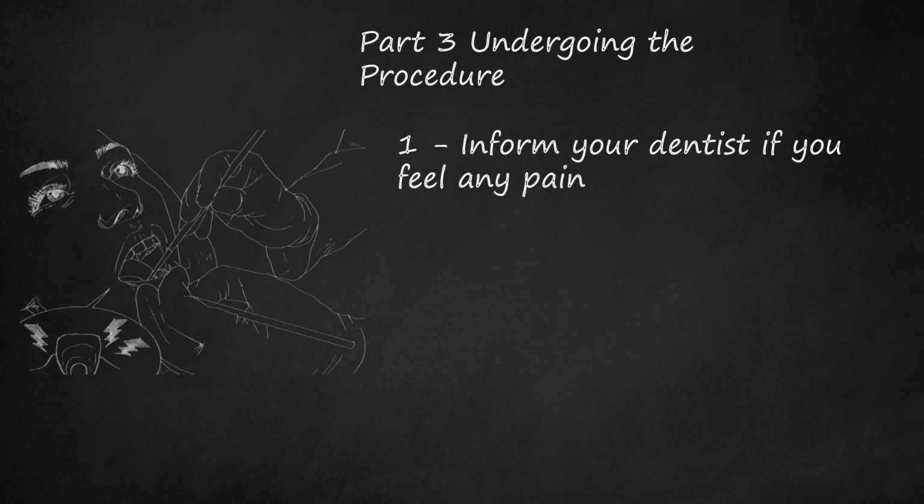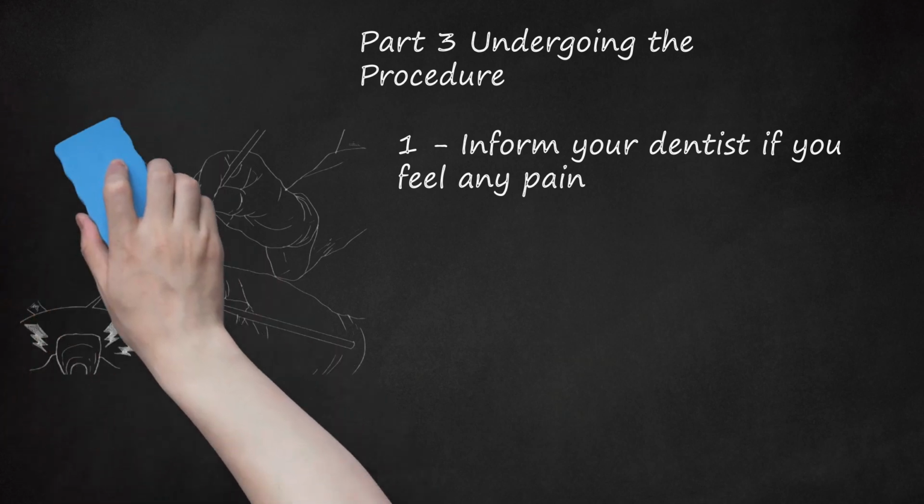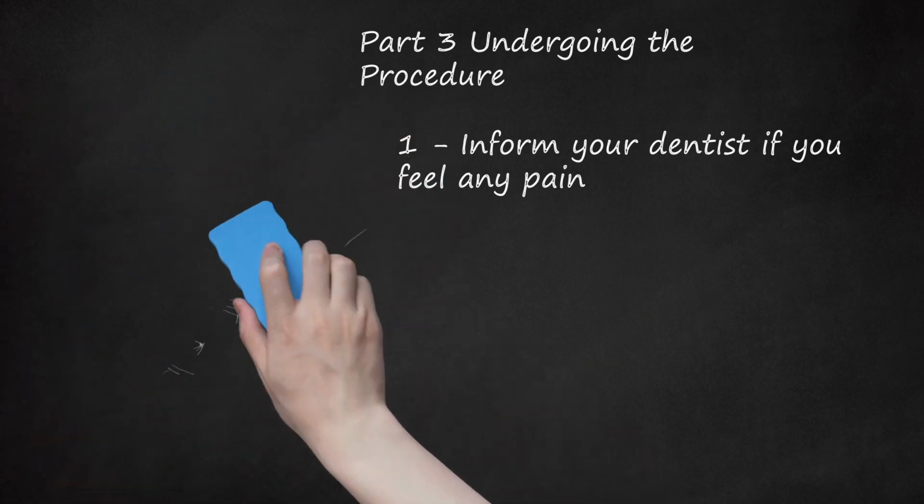You may feel a short impulse when the file passes through the end of the root in the bone. That's the sign that the entire root canal was cleaned and your dentist can calculate exactly the length of the root.